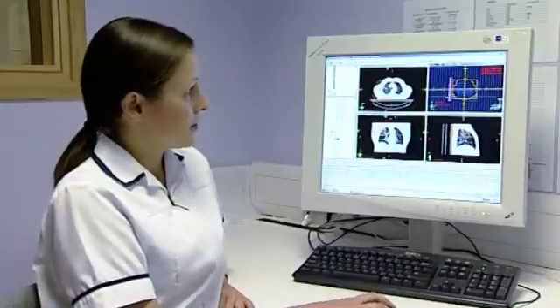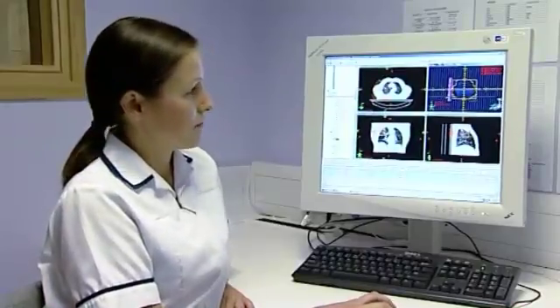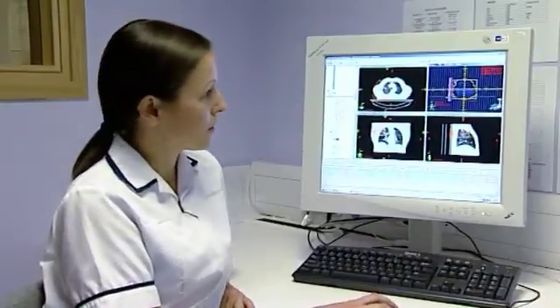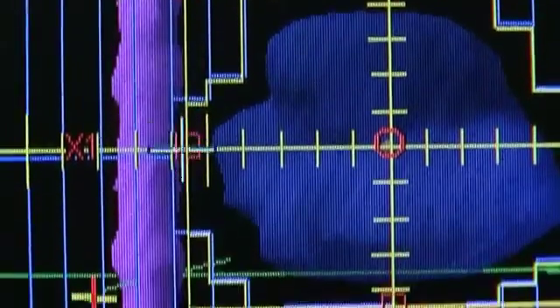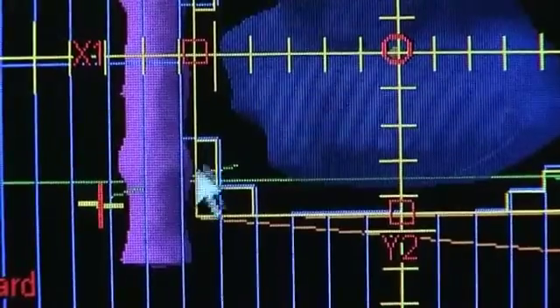Also, we can see that the spinal cord is very close to that field, so by applying these MLCs here we can make sure that the spinal cord doesn't receive full dose from that field.